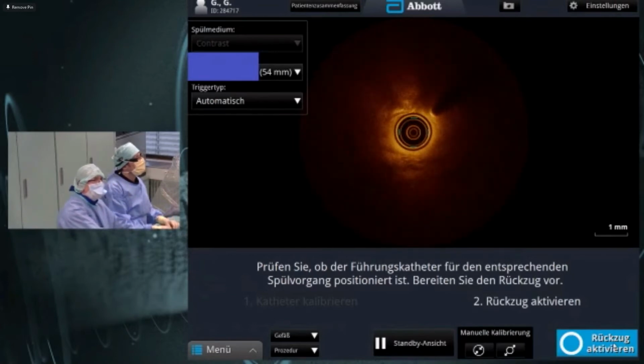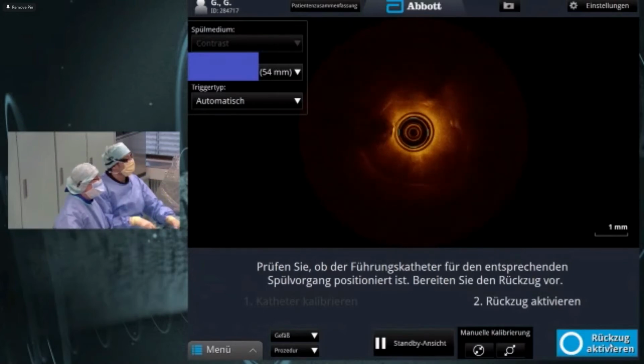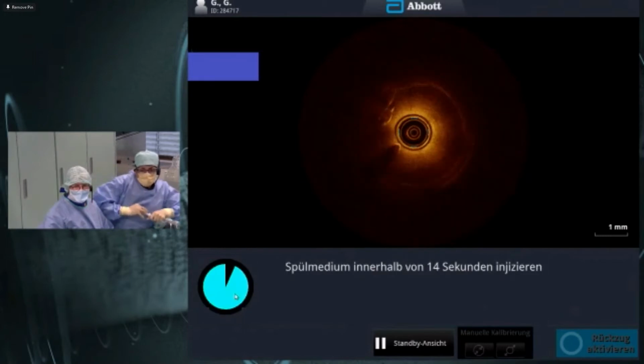So you will see now again OCT live, how it looks after IVL.